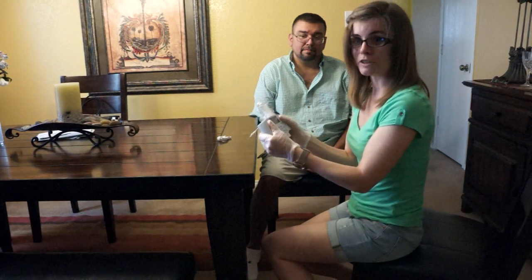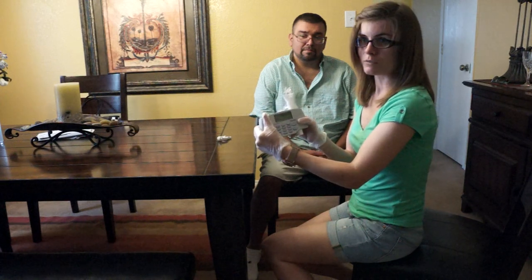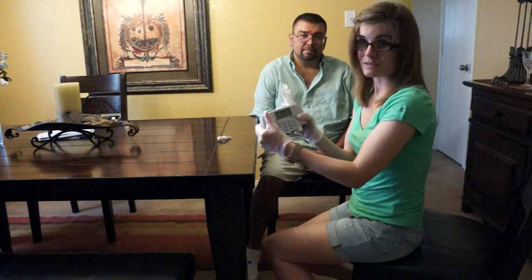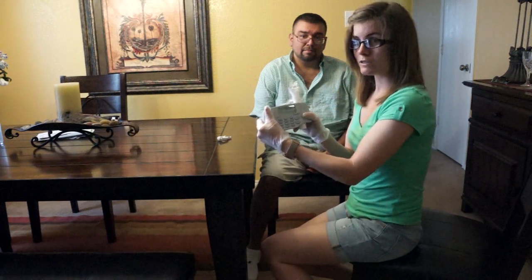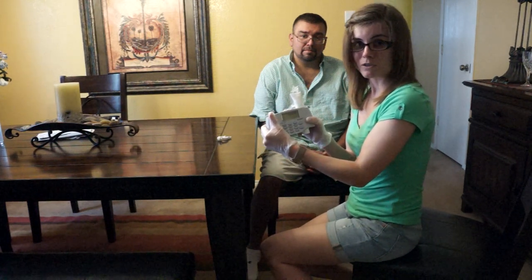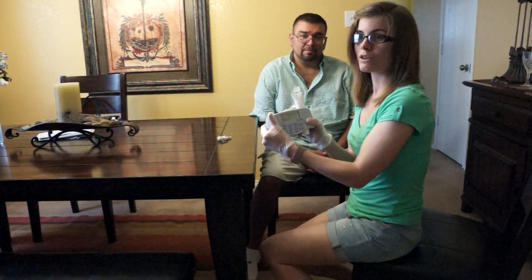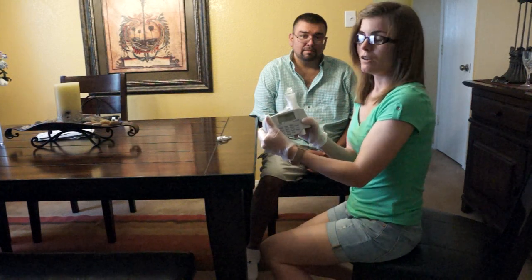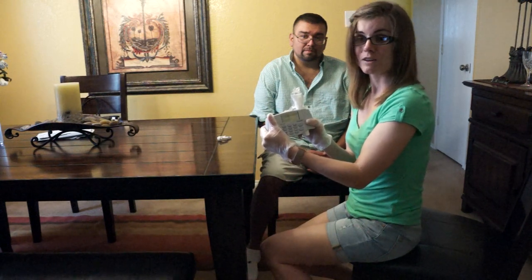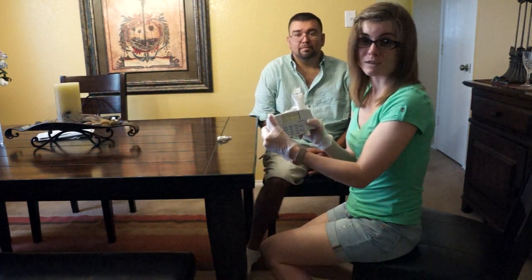There's a software, it's called NHANES 3, and that's the software that's inside the spirometer that has the right demographics that you need to perform this test through the American Thoracic Society. Now also, on these tests, it does measure whether or not the variable is different. So also with the American Thoracic Society, they require that you do 3 acceptable maneuvers within 150 mLs of each other to have it accurate. You want 3 tries. You get a max of 8 tries in one sitting. And so you want to make sure you have 3 good ones out of 8 tries.